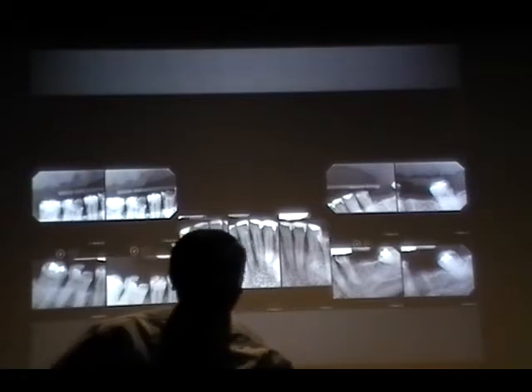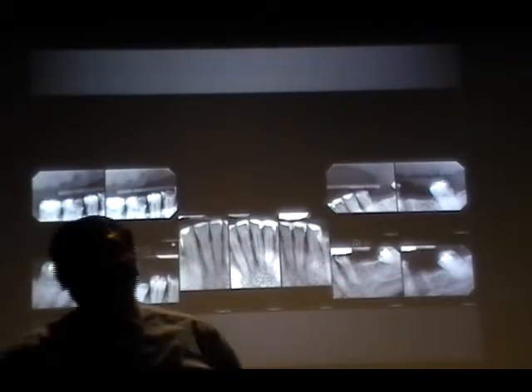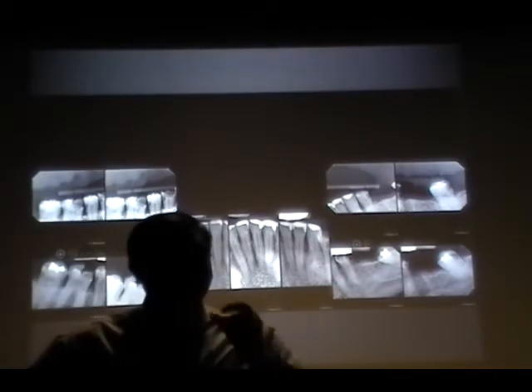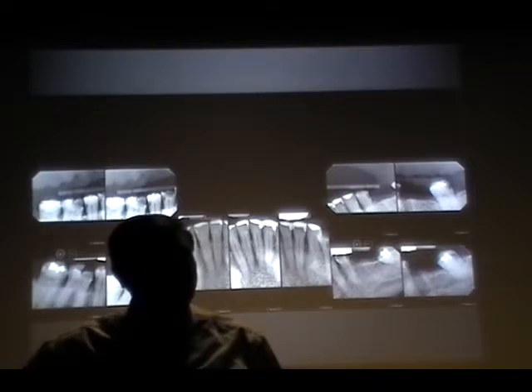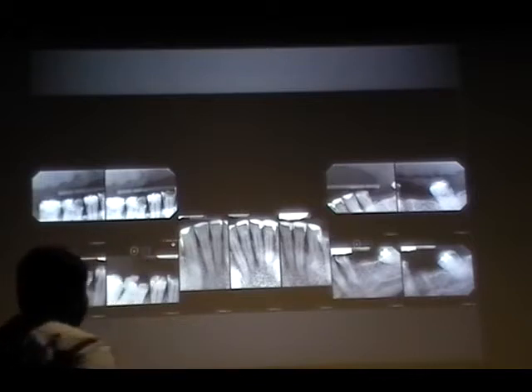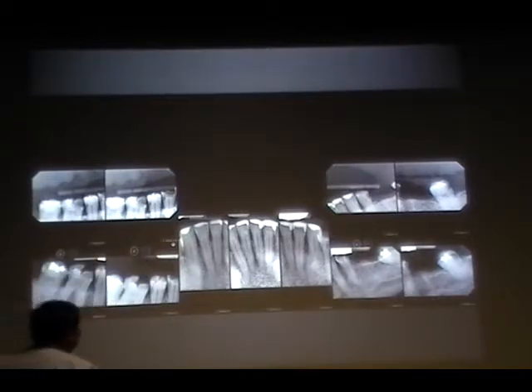How about this one? It looks good. There's open contact and you see the apex of each tooth. What are the teeth that you want to capture in this?